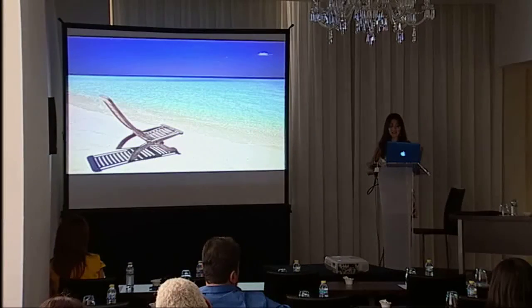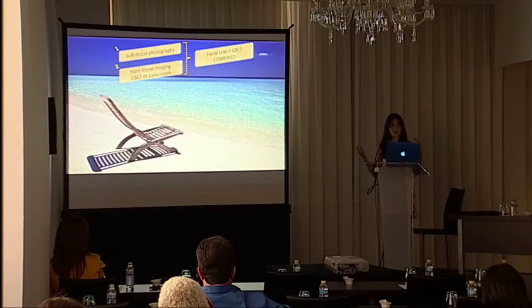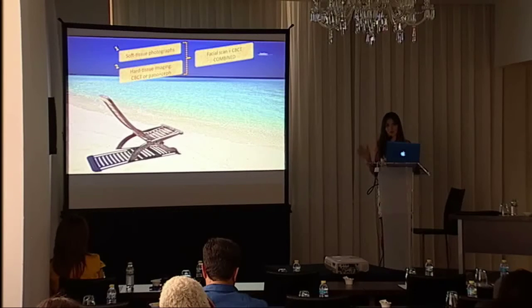So, taking it a step further, instead of still taking soft tissue photographs and hard tissue imaging separately, our aim would be to combine this classical two-step procedure into one-step procedure where the facial scanning is combined to a CBCT. Thus, the patient only goes to one place, to one machine, and in one exposure, you have the patient with you on the computer, even when the patient is not there anymore.